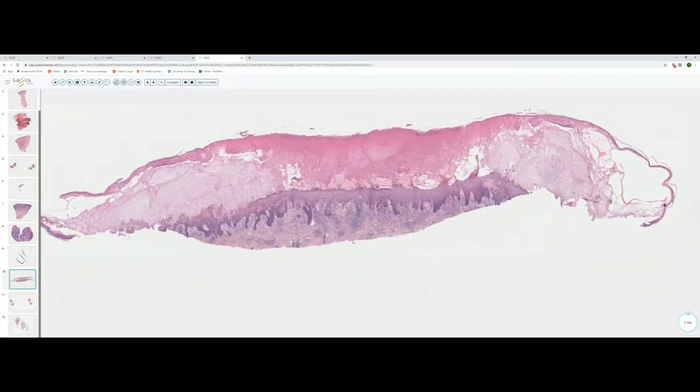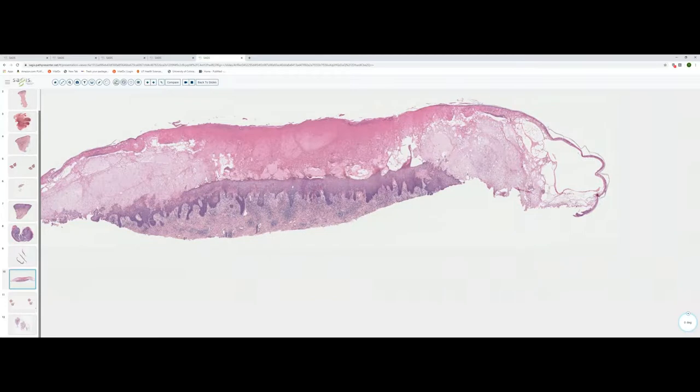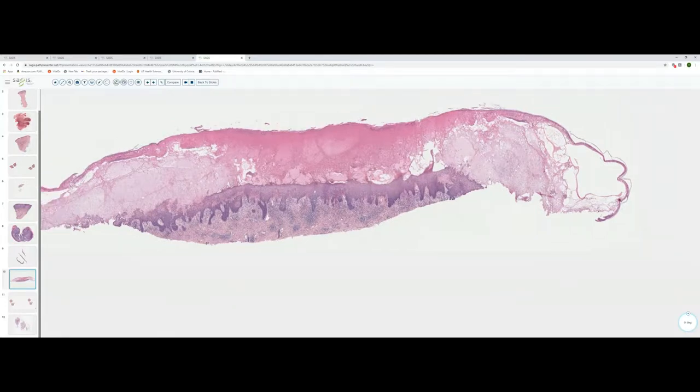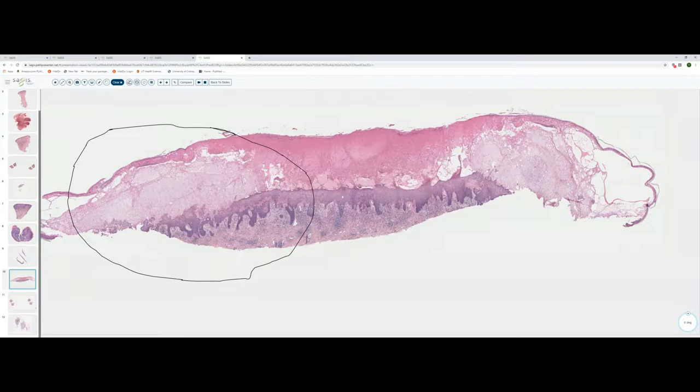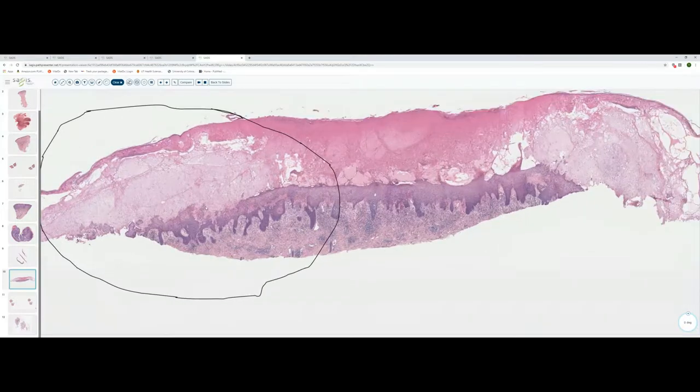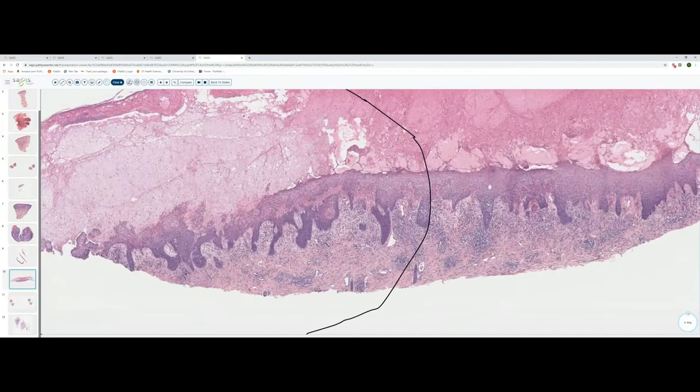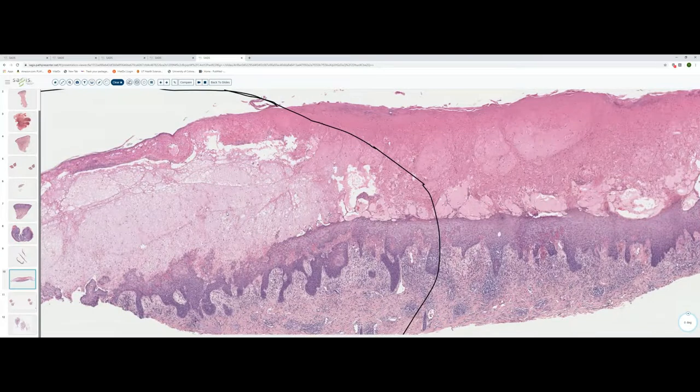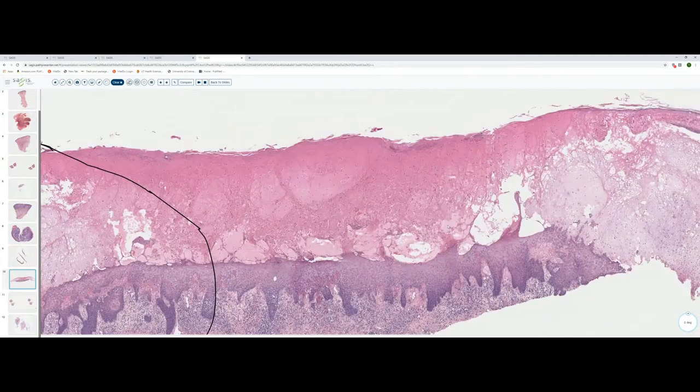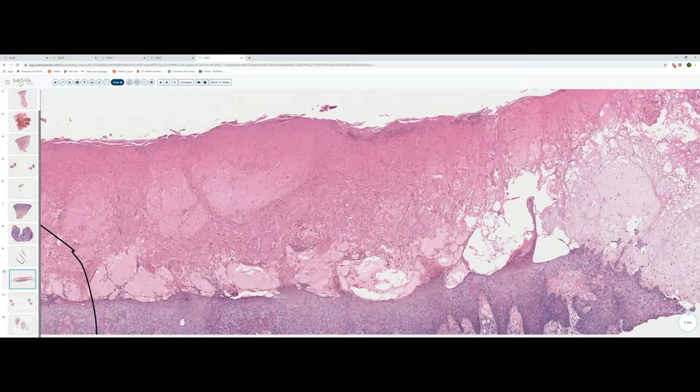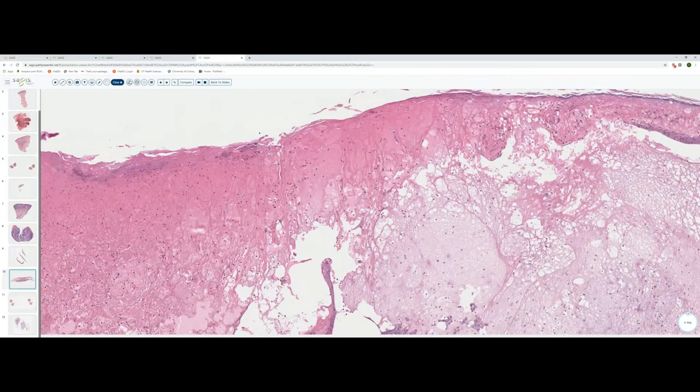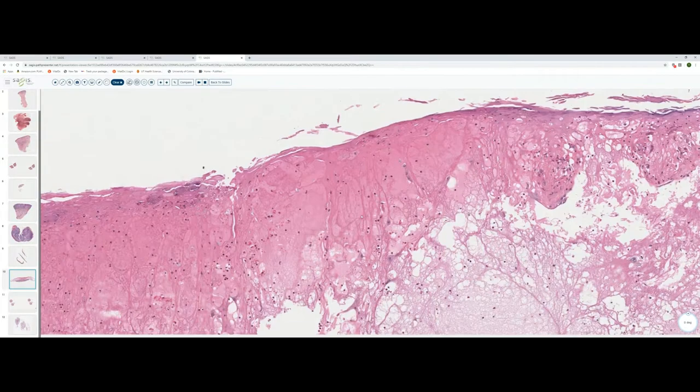Moving on to slide ten. Slide ten is a shave biopsy. And one could see a fairly brisk inflammatory infiltrate within the dermis. Obviously the most striking change is within the epidermis. And one can see a very large intraepidermal vesicle here within the epidermis. There may be some evidence of re-epithelialization here. And you remember when we met last week, we talked about the fact that when you assess an intraepidermal vesicular dermatitis, one of the crucial determinants is how this blister formed.